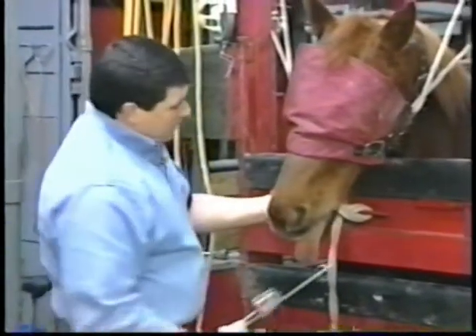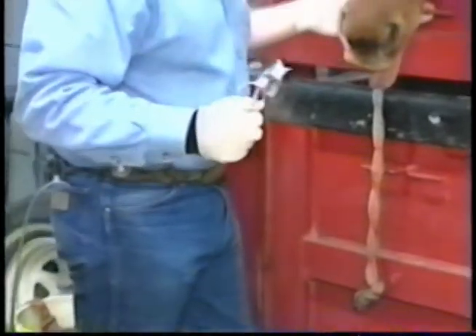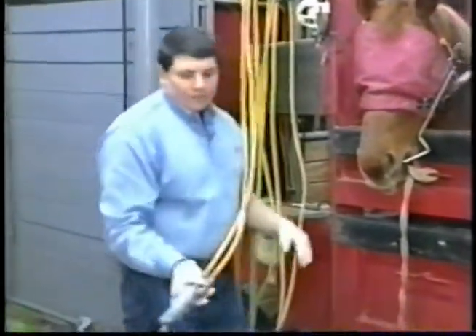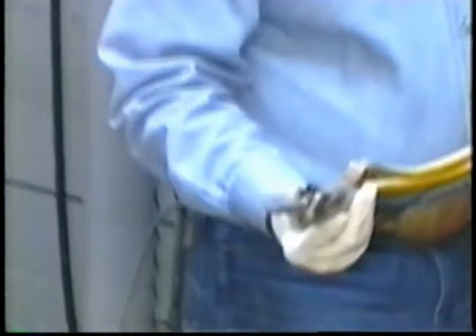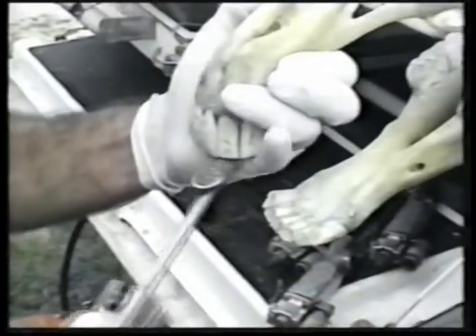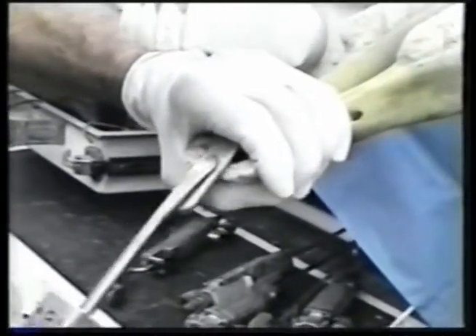Once the basic dentistry at the back of the mouth is done, we use a tongue relief dental wedge that pushes the tongue out of the way so that we can work the incisors if we have any incisor abnormalities. Lateral excursion is evaluated. Once we know what the lateral excursion is and whether we need further work, we use an instrument with both a coarse cut and a fine cut bit, which is used across the front teeth to work away smiles or any abnormalities such as a smiley face. We also work canines at the same time with this instrument.